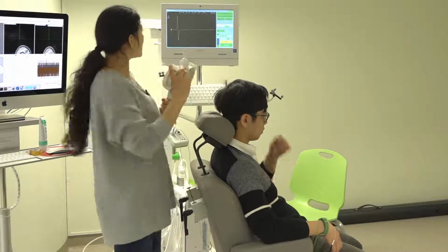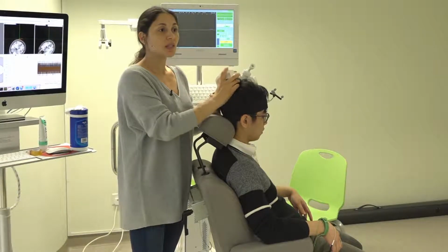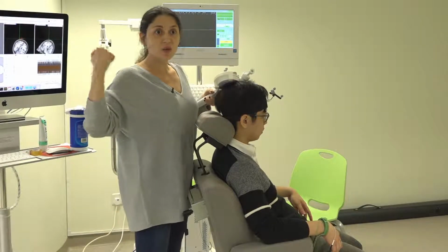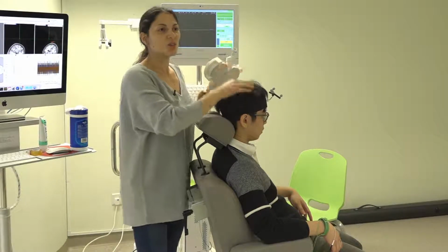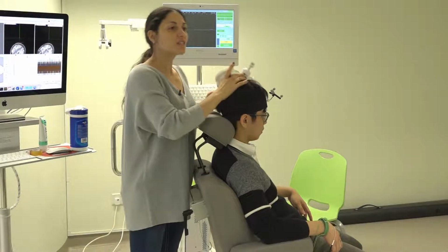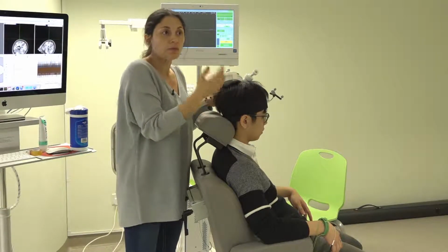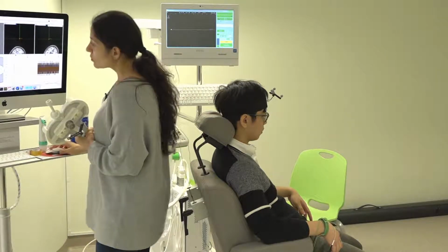The cool thing is that normally when I get a signal like this and I did it 3 times, if I don't have this fancy equipment, what I will do is with a marker, I will put a red mark here. Someone who doesn't know will be very scared because they will see this and think, oh, it's blood. It's not, but it happened. So I will put a mark just to check if that could be a spot that is valuable, that is probably my hotspot.